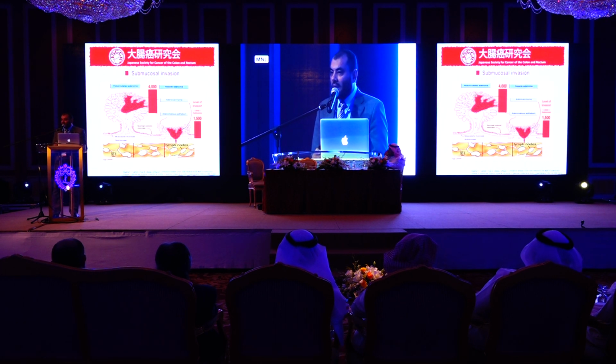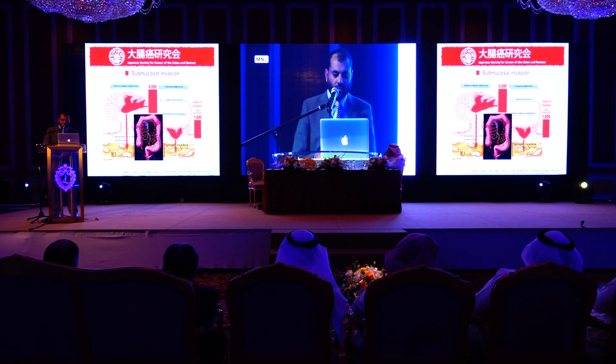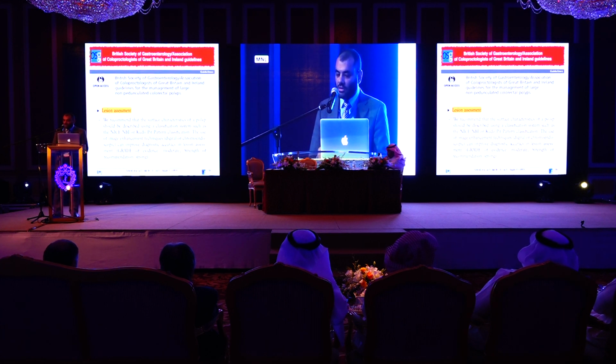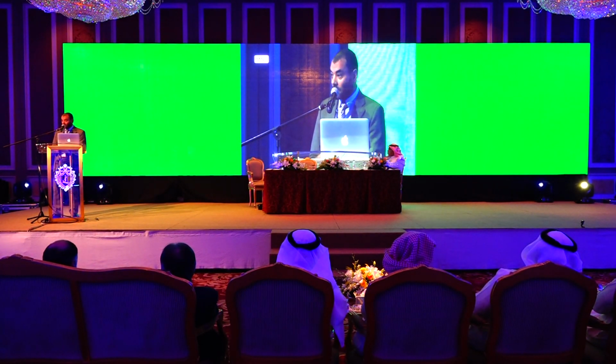What is the meaning of that? If there is no lymph node metastasis, I can remove this lesion endoscopically. But if there is lymph node metastasis, you cannot remove it endoscopically, because the patient will come to you after a few months with recurrence. So how do we know this level of invasion and how accurate is your assessment? The Great Britain and Ireland guidelines 2015 strongly recommended the use of advanced endoscopic imaging to assess submucosal invasion and to predict the histology.